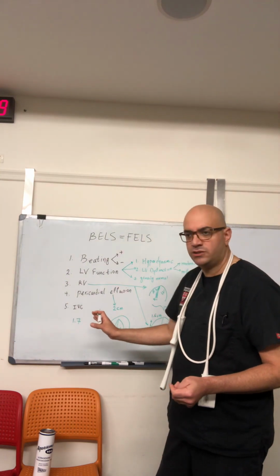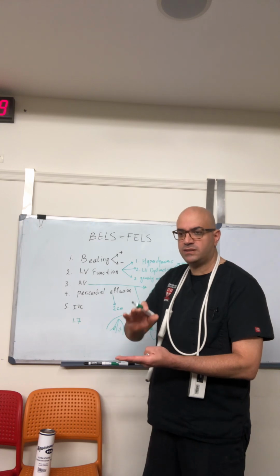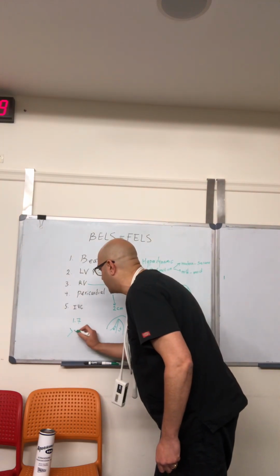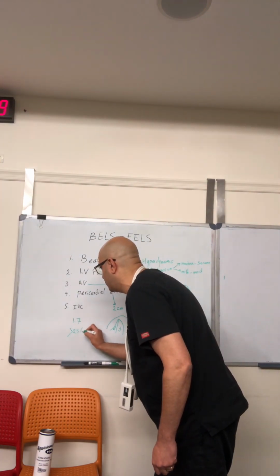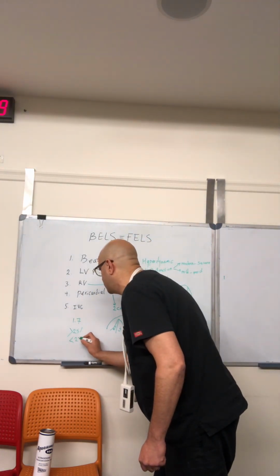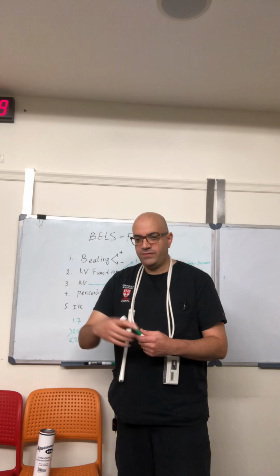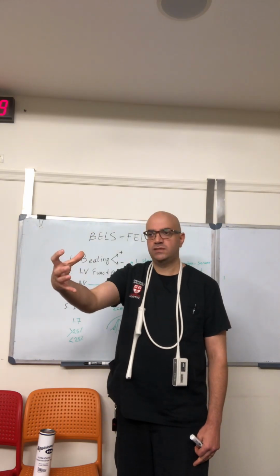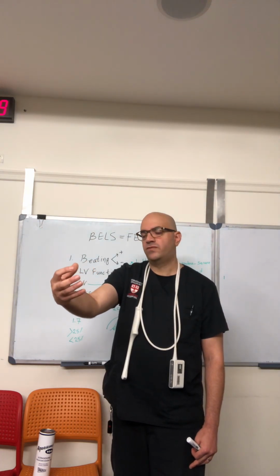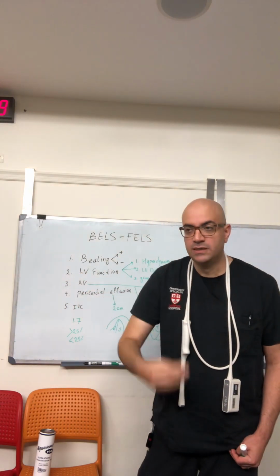The other parameter you measure is in inspiration and expiration. What is the size? What's the difference? What's the percentage that it collapses? So it's called collapsibility. If it is more than 25%, it is either normal or high collapsibility. If it's below 25%, it's abnormal or less collapsibility. So IVC, if it is plethoric, say 2 centimeters, and it's not collapsing, that's showing your patient's likely fluid overloaded. But if it is, for example, 0.5 centimeters, completely collapsing, your patient is likely empty.